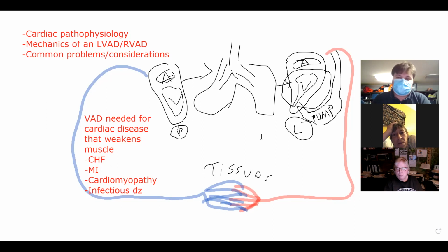That's probably one of the least likely scenarios that you will see in someone with a ventricular assist device. More commonly, this is just meant to be a supportive measure to bridge them the rest of their life, or to get them through until they can find a donor heart or heart transplant. Any famous people come to mind for you when you think of ventricular assist devices?